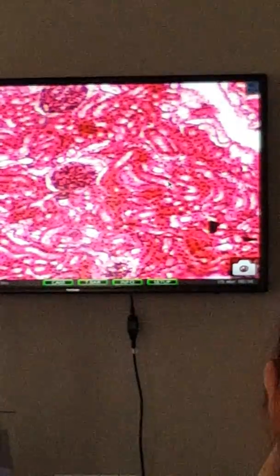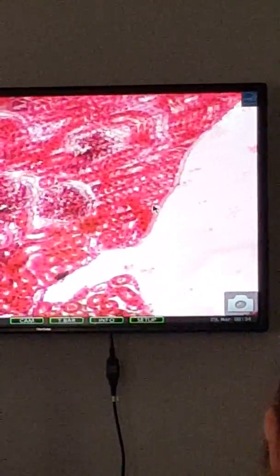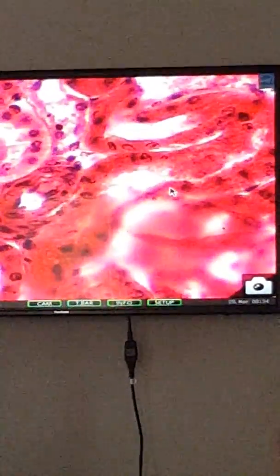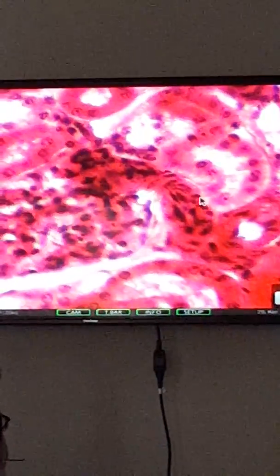Okay, let's go low power again. All right, this is very interesting.